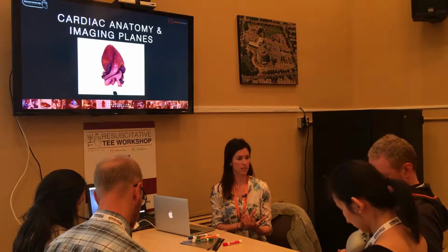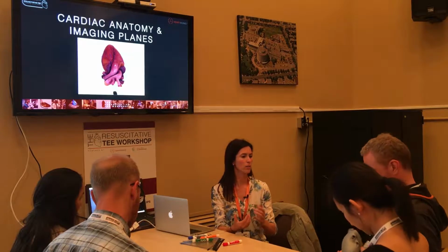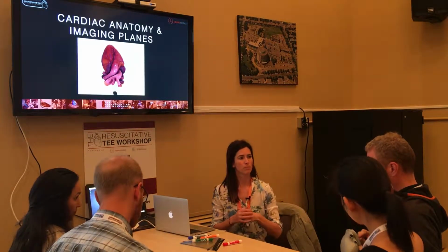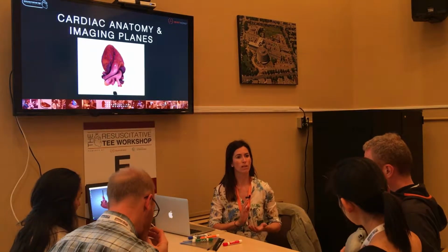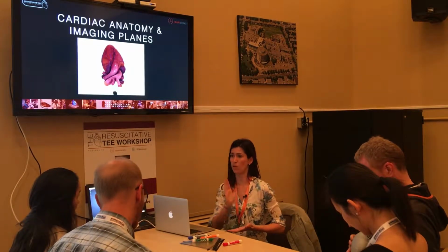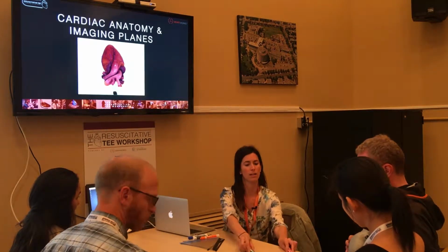Okay. Great. So there's a few things that can help us out. Looking at the back of your heart, we see a vessel that's coming straight down here. What's this? The descending thoracic aorta. Exactly. So we know that that's going to be kind of the most posterior structure. It's going to be kind of straight up and down before it curves over into the arch. Okay? So everyone's going to get a probe now.